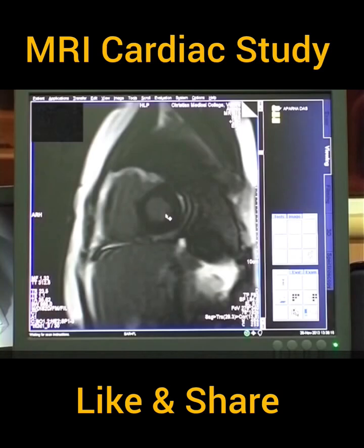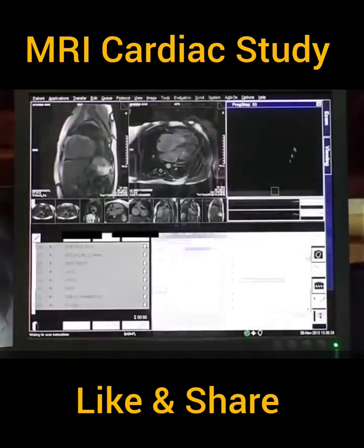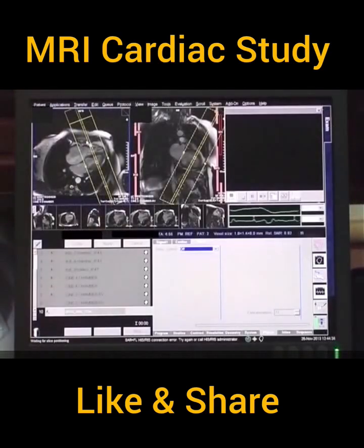In this study, it is approximately 340 milliseconds. The value of 340 milliseconds is entered and delayed hyperenhancement images are taken in all 3 planes.